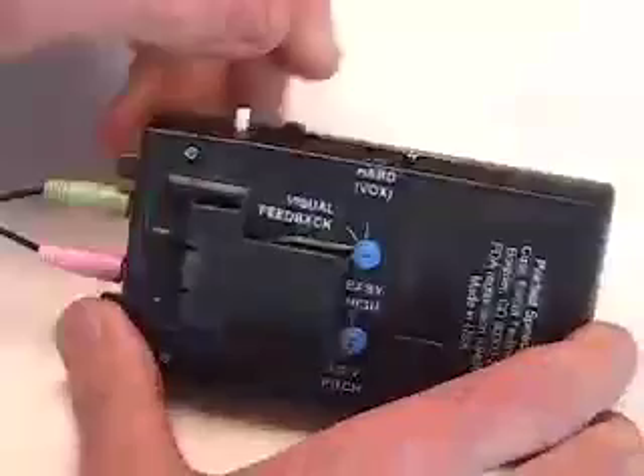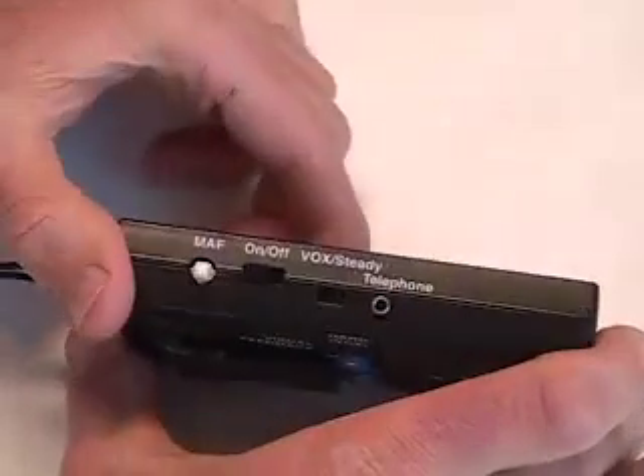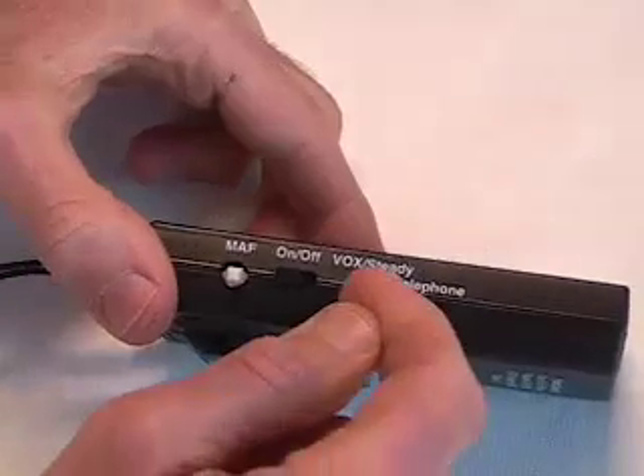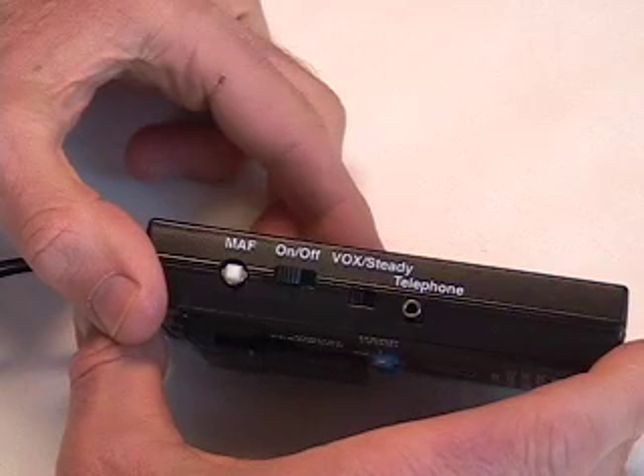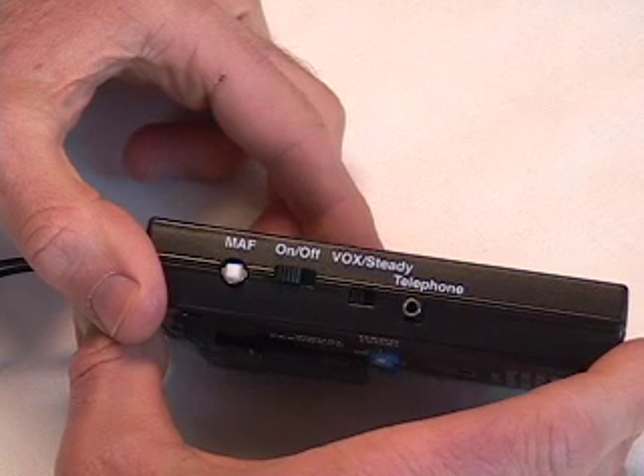You can switch the device so that the DAF/FAF sound is always on. Or you can switch the device so that the sound is on when your voice is tense, but off when your voice is relaxed.